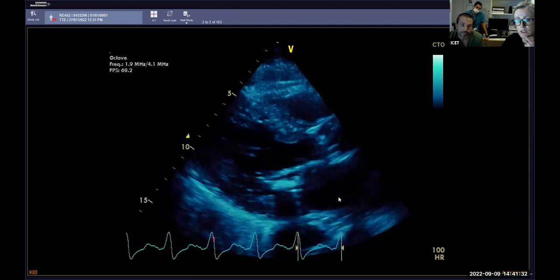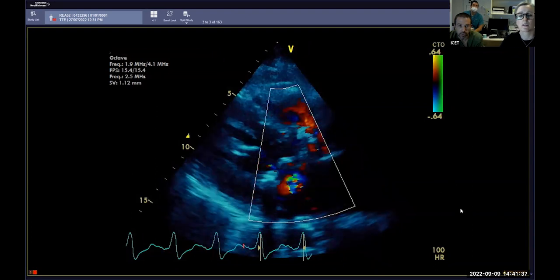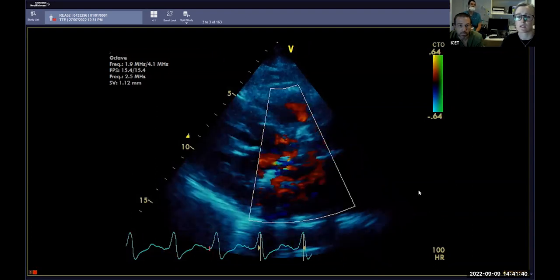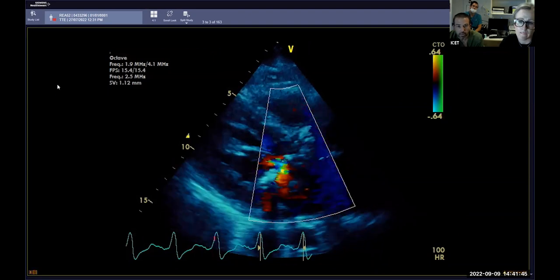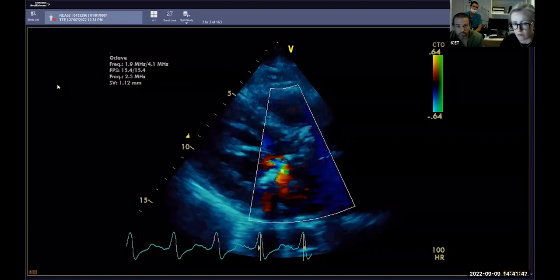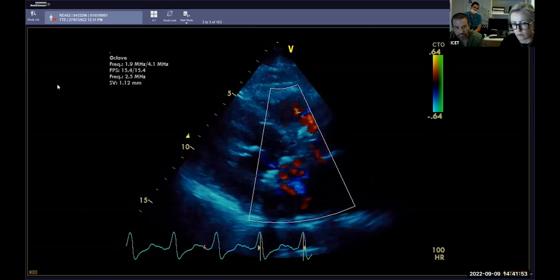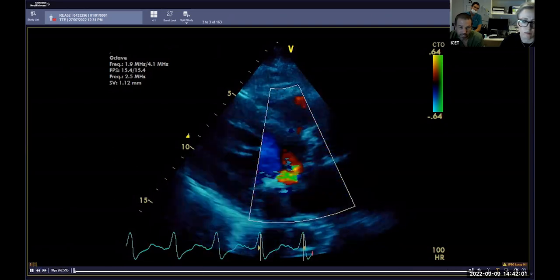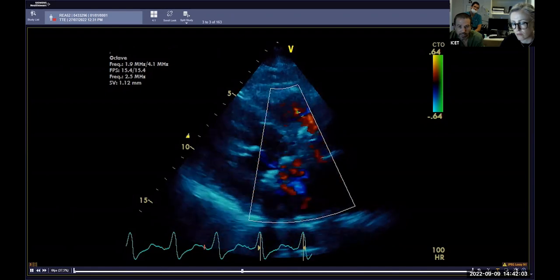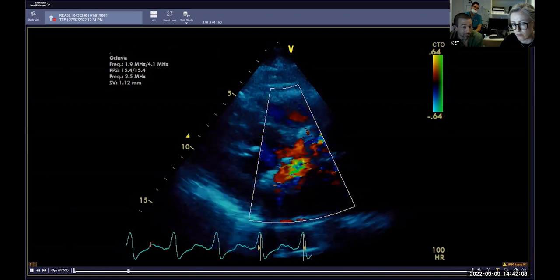So okay. Let's have a look through. Put color over them all and zoom. So from what I can see, it looks to be high velocities around the mitral valve due to some mitral regurgitation. In this view, I can't make a great assessment as to the severity of it. There's probably a little bit of play, but I can't see a large jet extending into the left atrium. More views. Off this view, I'd call it probably just mild.